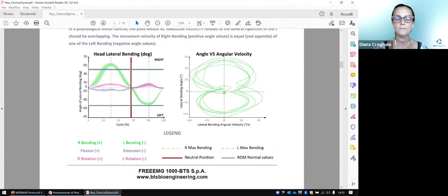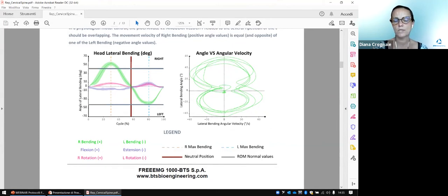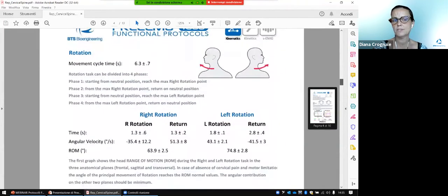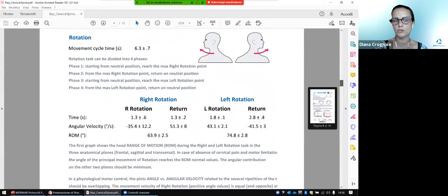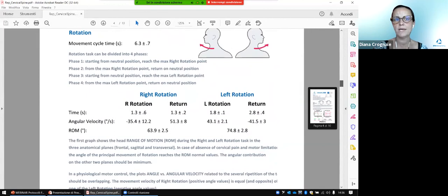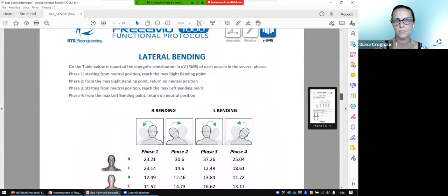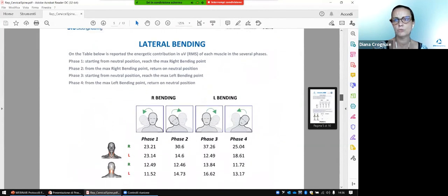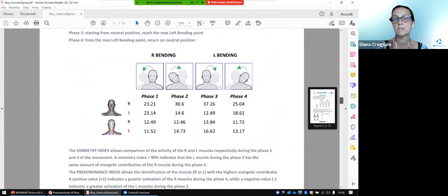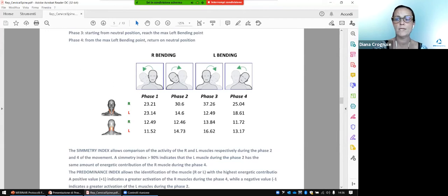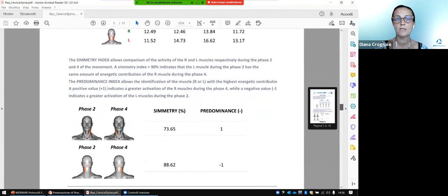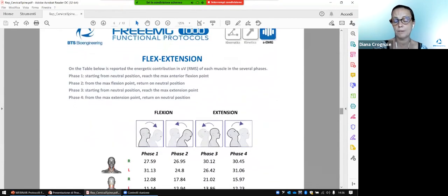About the muscle work, in the next pages we have the kinematic information for the flex extension and rotation movements. Then we arrive at the muscle work page, where we find the energy contribution that each muscle is giving out in the different sub-phases of the movement, and we can assess symmetry indexes to highlight the patient's capability to use right and left muscles in the same way while performing the movement.